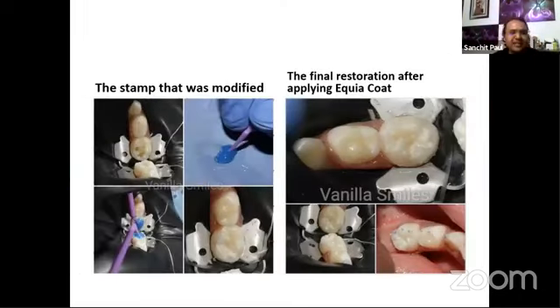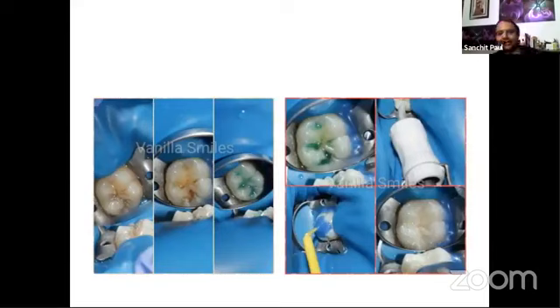Now, the technique is simple. We really need to elaborate on that. But basically, we can use a liquid dam or very unfilled resin over there and press it with the cut portion of the microsponge brush and quickly light cure it, get the stamp out, then do a restoration preparation, and then put that stamp with a layer of glycerine so that it doesn't stick, and then light cure it.